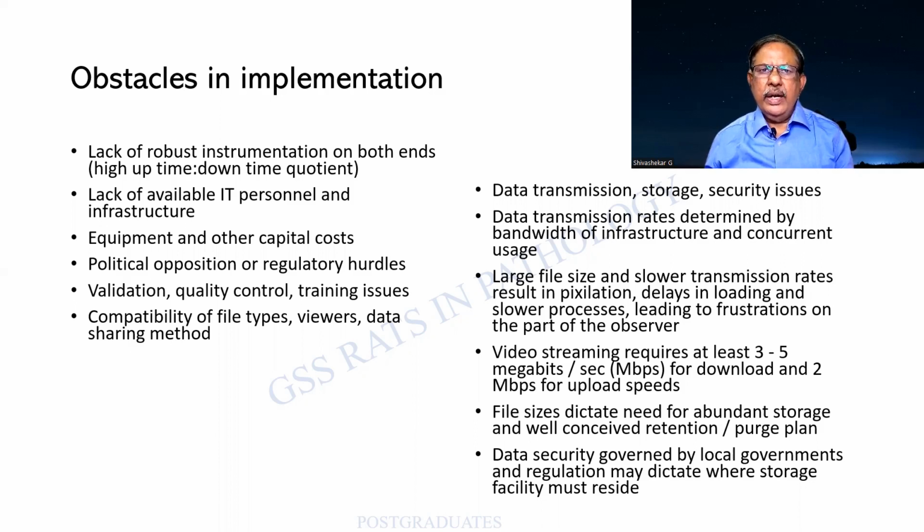The higher the resolution, the higher will be the cost. And for real-time pictures, the cost can be exorbitant. Finally, what is the control for all this? If it is being done by a technical person, he will not be aware of even hematoxylin and eosin colors. And what is the data that is going to be transmitted and stored? There are security reasons also. As I mentioned earlier, if a VIP is going to have a suspicion of malignancy, how correct will it be for me to send the slide to different countries?